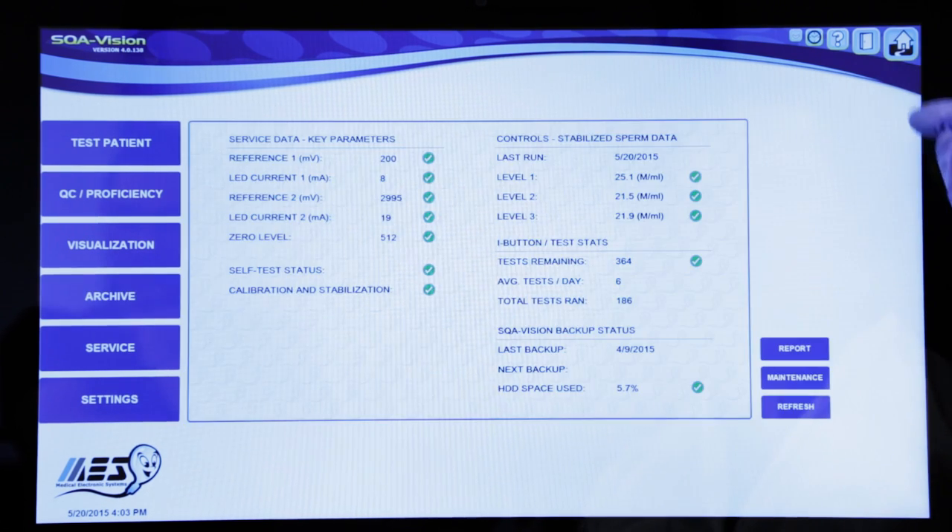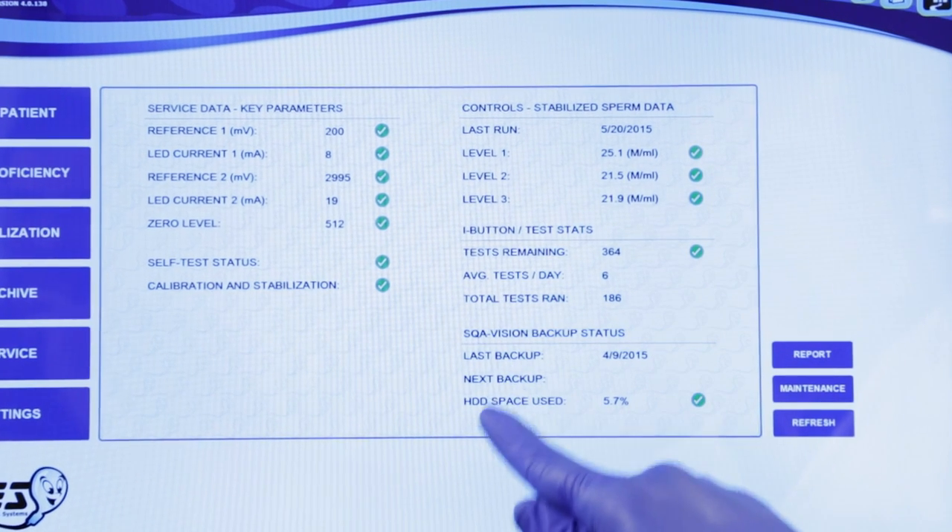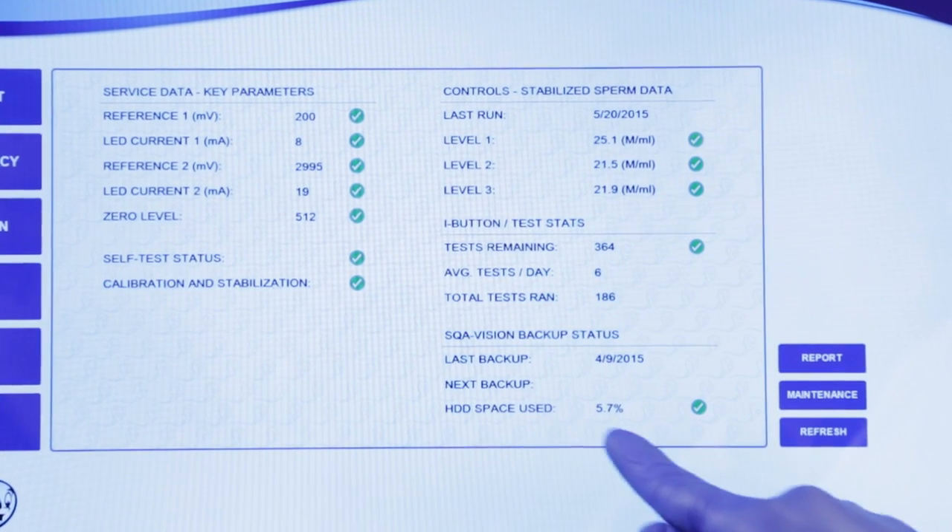To keep your data safe, the Vision will back up your results automatically based on time intervals you define, display your hard drive capacity, and let you know your average test per day volume.